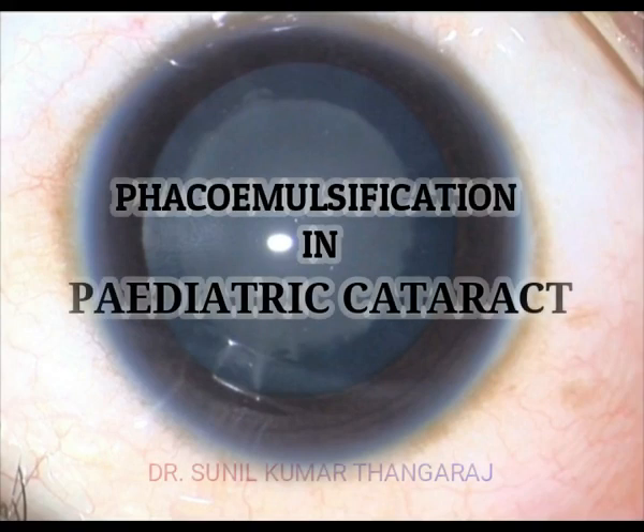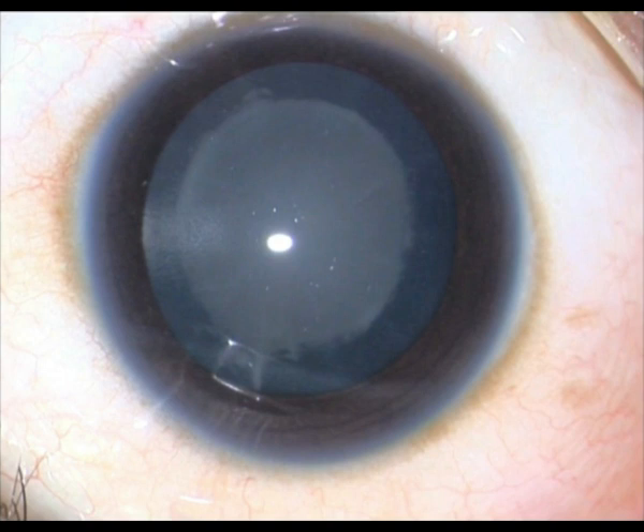Hello. I will be showing a very old video of mine where I have done a phacoemulsification or phaco aspiration in a congenital cataract.